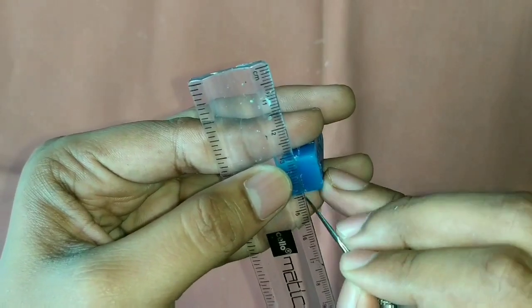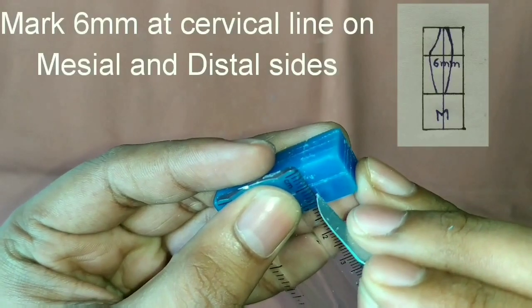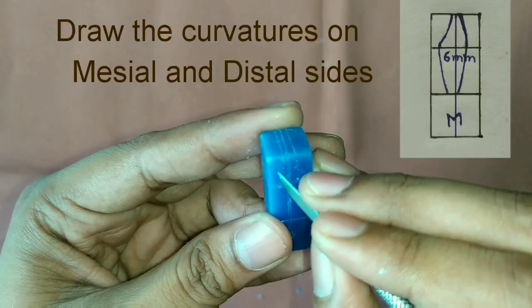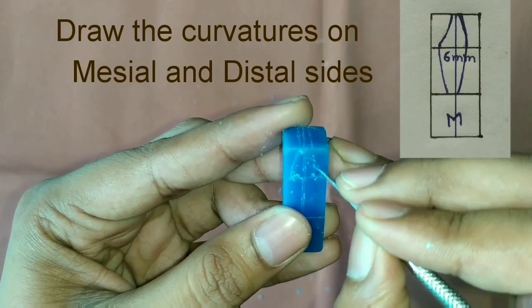Mark the central line on the upper surface. Then take 6 mm on the cervical line of the mesial and distal sides. Then start making the curvatures as shown in the diagram.